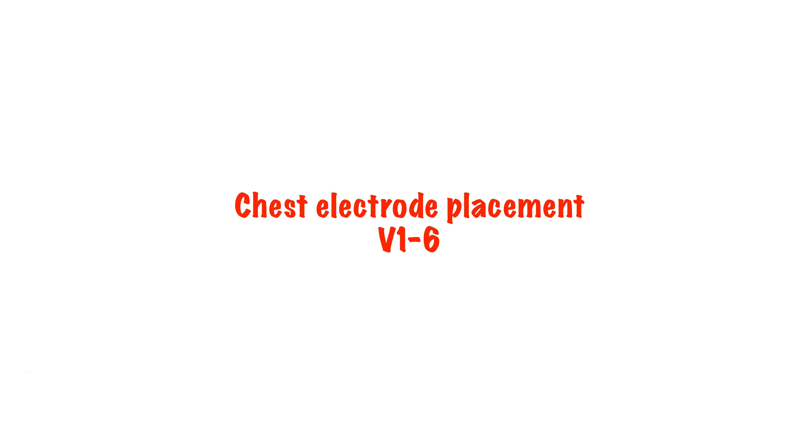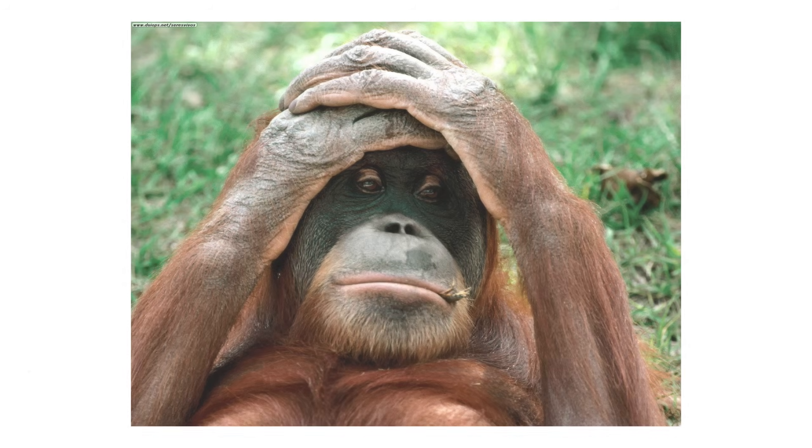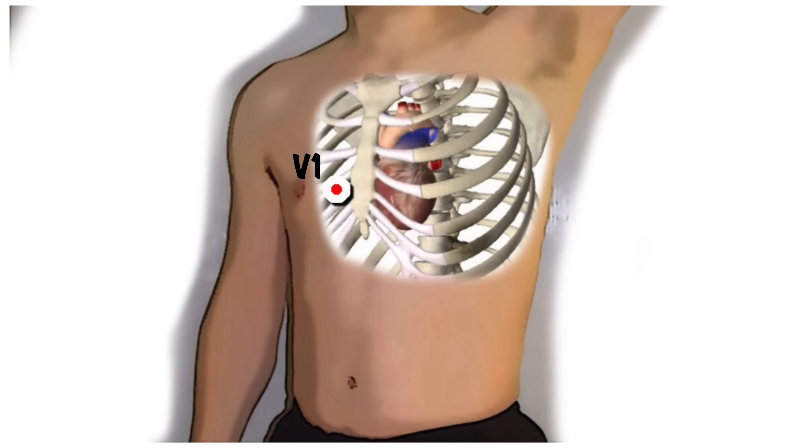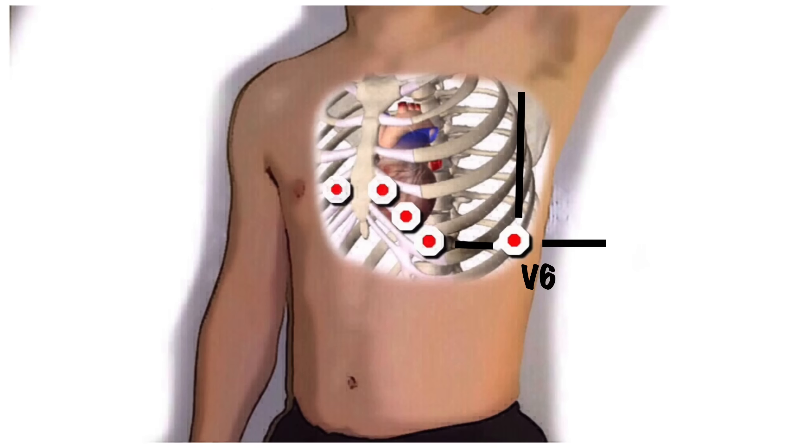Next, place your six chest leads, V1 to V6. If the patient is particularly hairy, you may need to consider shaving patches of hair so that the electrodes can come into contact with the skin. V1 goes on the 4th intercostal space on the right sternal edge. V2 goes on the 4th intercostal space on the left sternal edge. V4 goes on the 5th intercostal space in the mid-clavicular line. V3 then goes directly between V2 and V4. V6 goes in the mid-axillary line in the same horizontal plane as V4. V5 goes halfway between V4 and V6. In ladies, the leads should go under the breasts rather than over them.